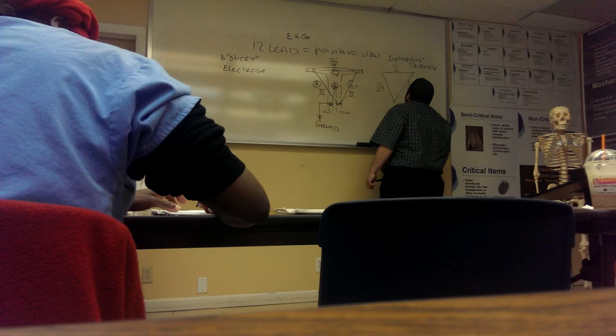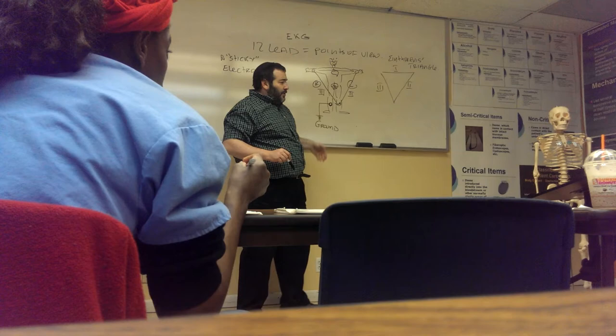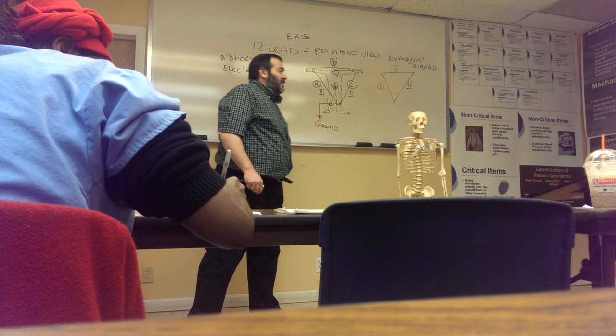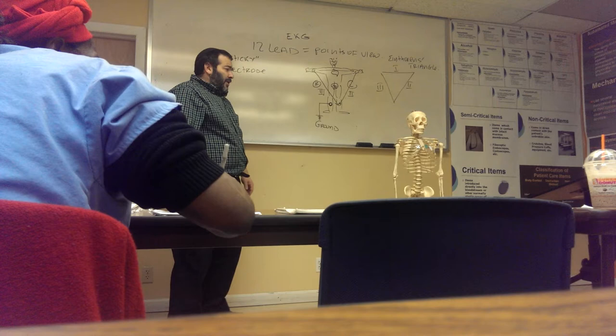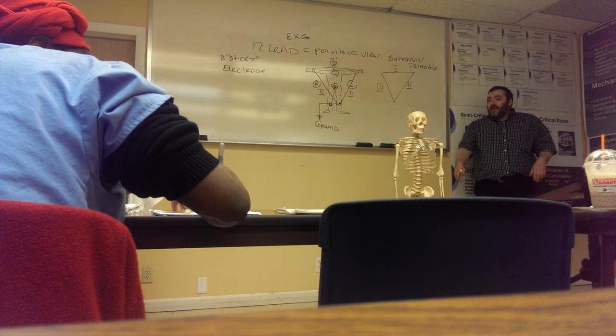So I have 3 points of view around my heart. I'm looking at the heart from there to there, from there to there, and from there to there. Now look. I'm looking at Henry the skeleton from here to here. This is 1 point of view. Then I'm going to look at Henry the skeleton from this view, and then from this view. Okay, does this make sense?